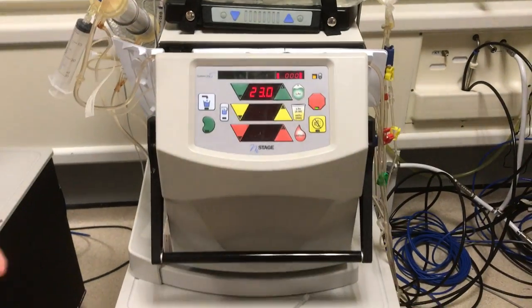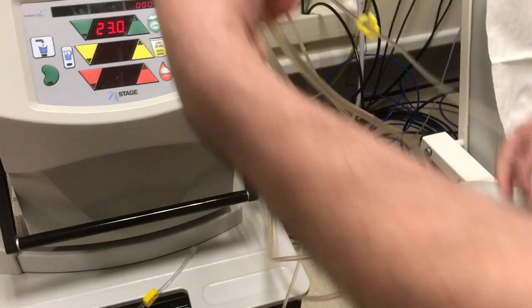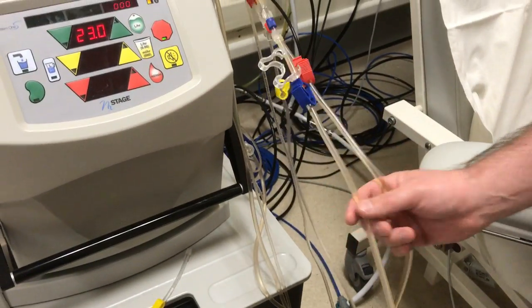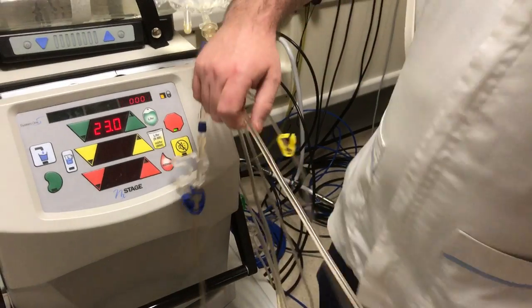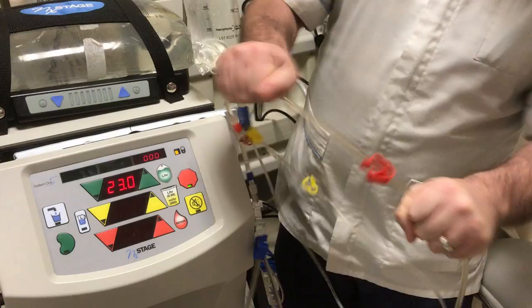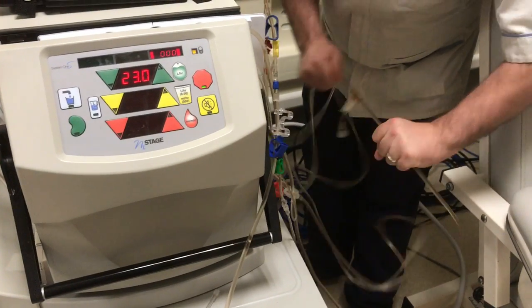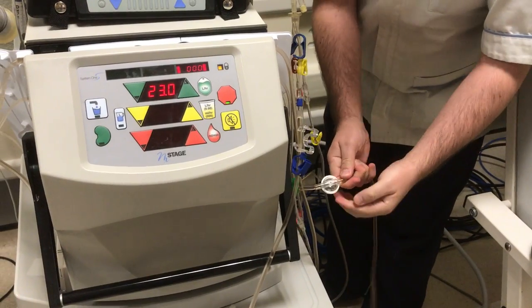We're now going to check the circuit for any air, so we're going to check the red and the blue lines. If you do see any air down the lines, especially the blue line, then we need to do the snap and tap. We do the snap and tap by getting the line about a fist apart and cracking the line, and we crack all the way down the red line all the way down to the pressure pod.